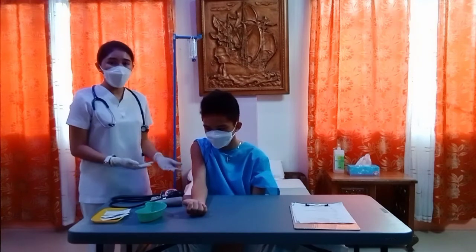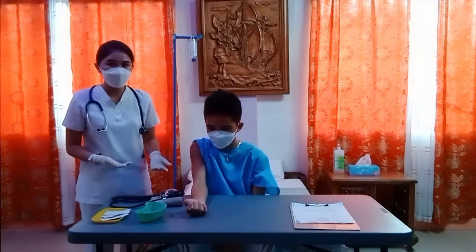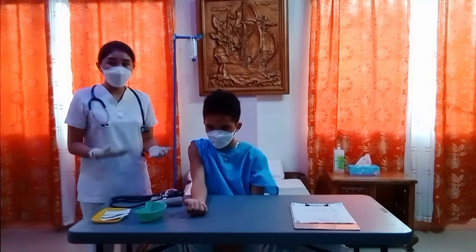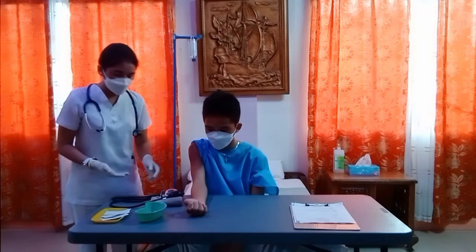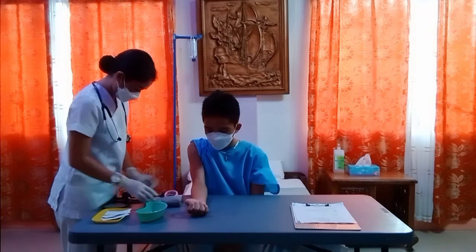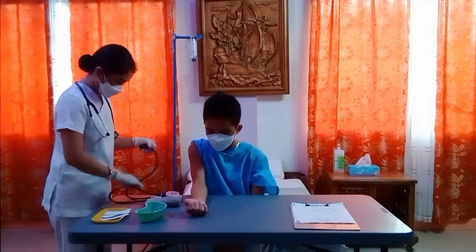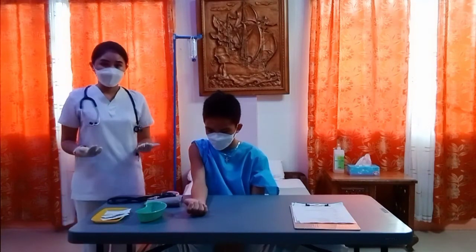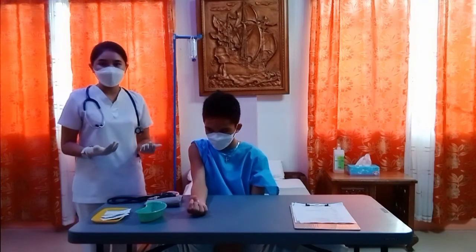Exposure of the upper arm will permit a better access of the brachial artery in order to attain accuracy in the procedure. Next is to make sure that the cuff is fully deflated and the valve moves freely. This is done to ensure an accurate and precise blood pressure reading in the preceding steps.